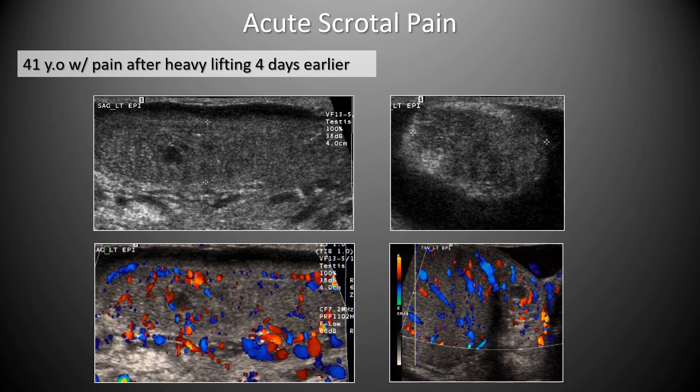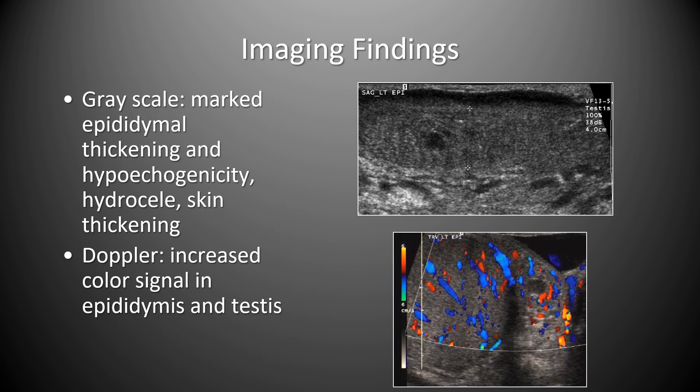A 41-year-old with pain after heavy lifting four days earlier showed marked epididymal thickening with hypoechogenicity and overlying skin thickening with a small hydrocele on grayscale ultrasound. On Doppler, there was increased color signal within both the epididymis and testis, consistent with epididymo-orchitis.